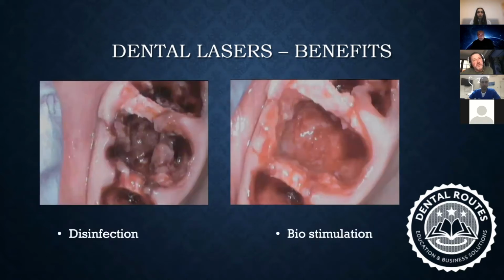Just a quick question there, Koushik. So when you are close to the tissue, you never touch the tissue with the tip. So actually, you're not having to rest the tip itself onto the tissue. I guess visually as well, that's a reassuring thing to be able to see. Yeah. When you're cutting a soft tissue, you always come in contact with the soft tissue. You do. But when you are cutting a hard tissue, you do not come in contact with the hard tissue.